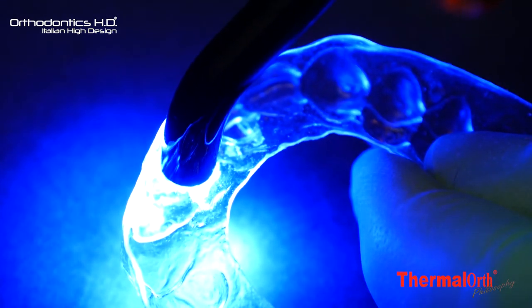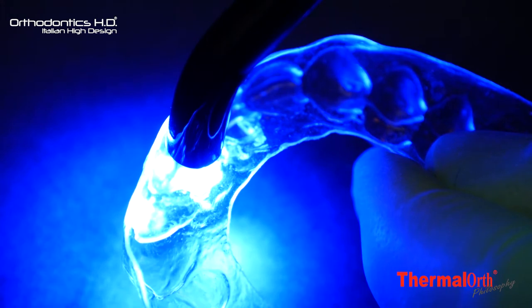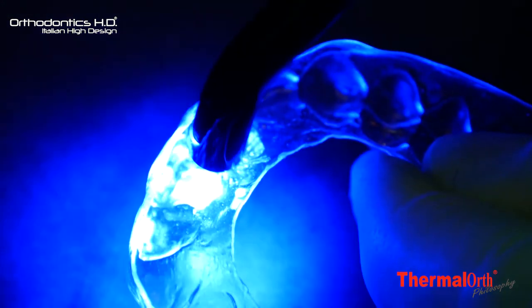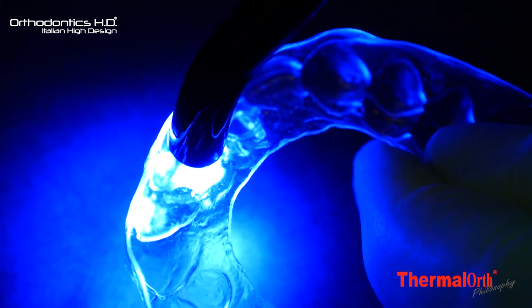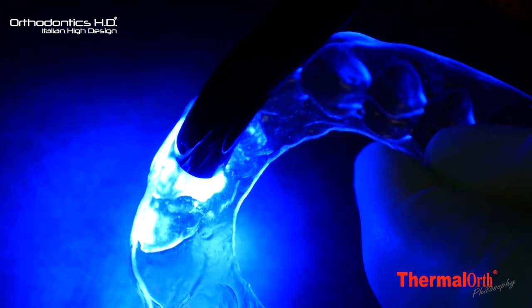In the final stage of the device monitoring on the patient, it is necessary to assess if the achieved plan has to be functionalized by any adjustments to optimize the occlusal treatment and also contacts with the antagonist teeth.